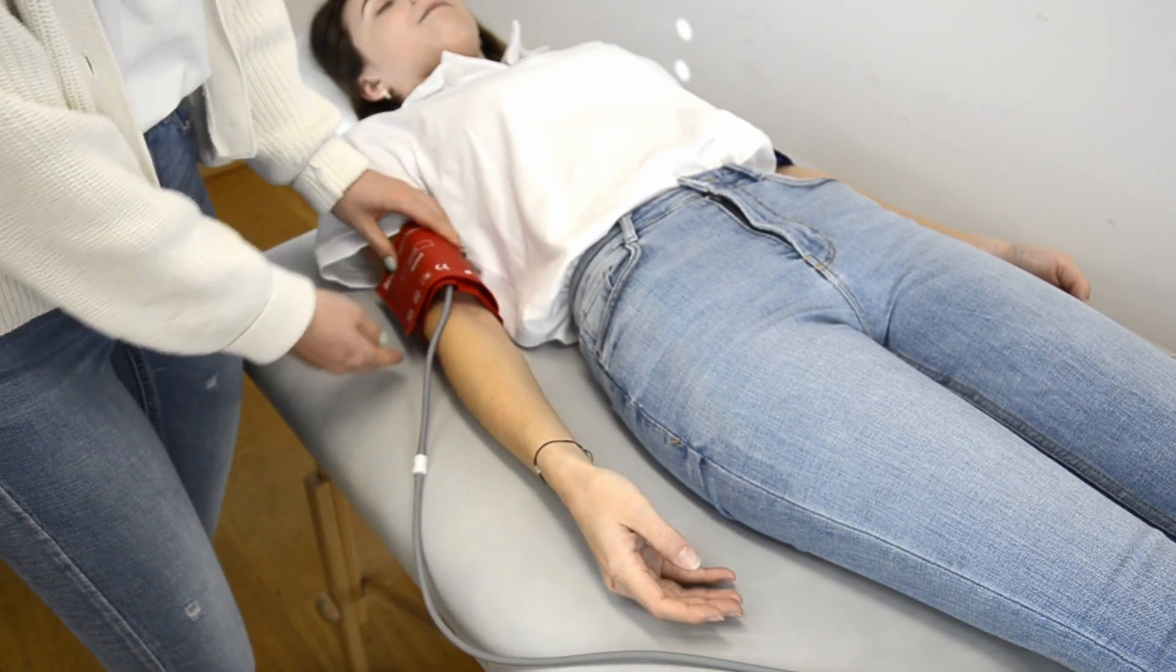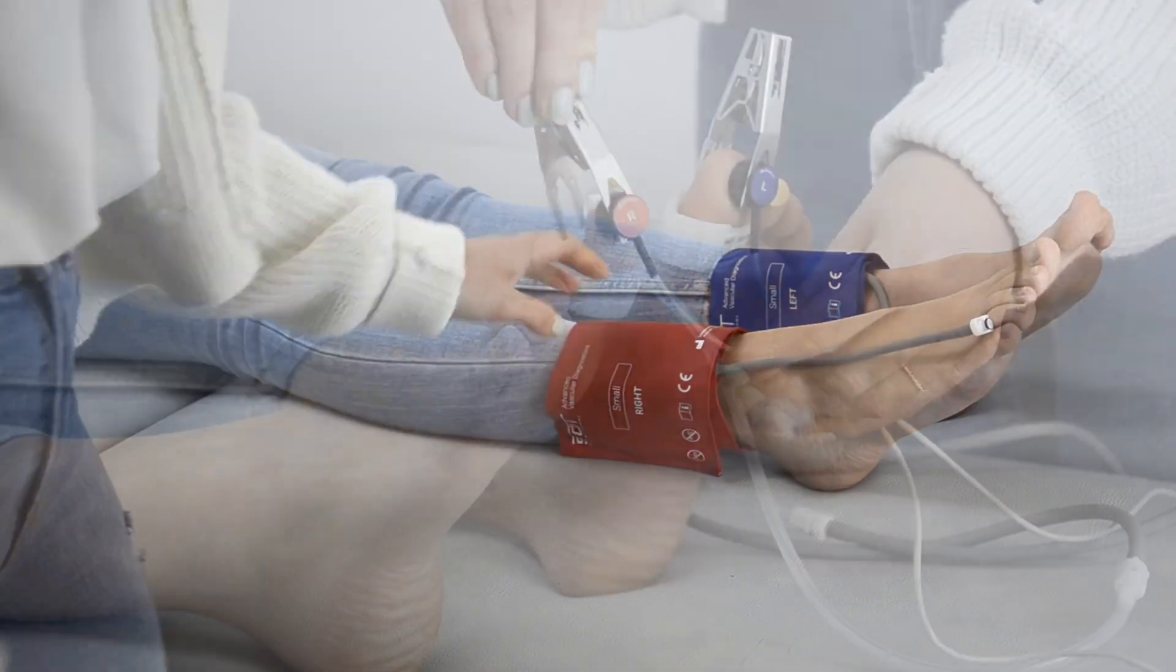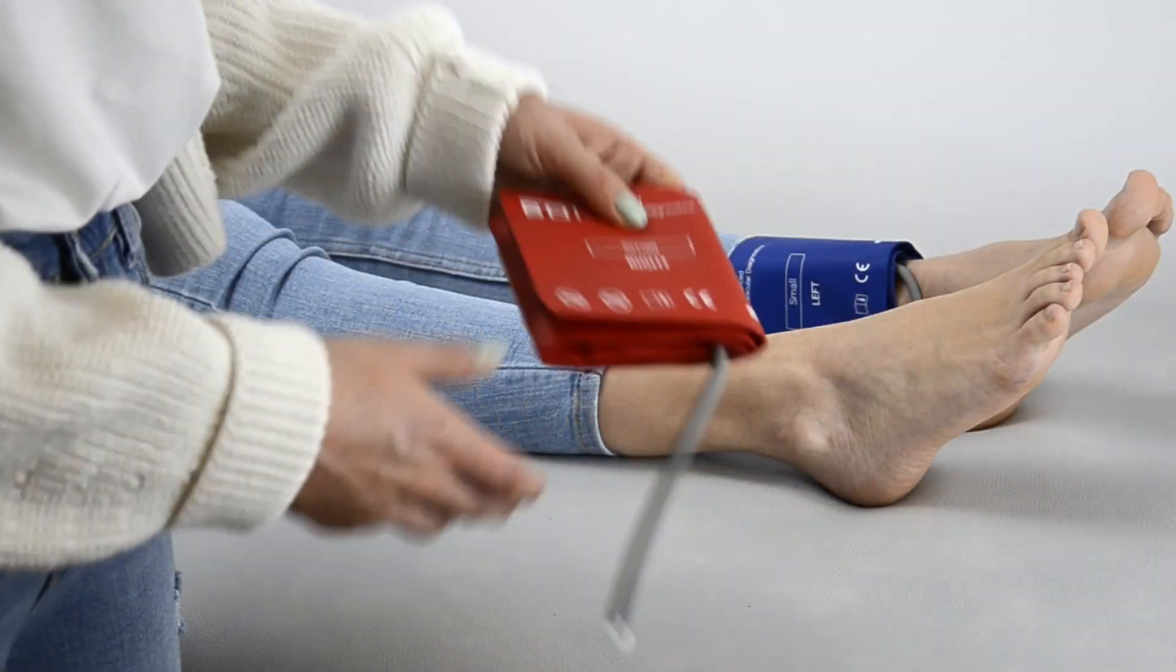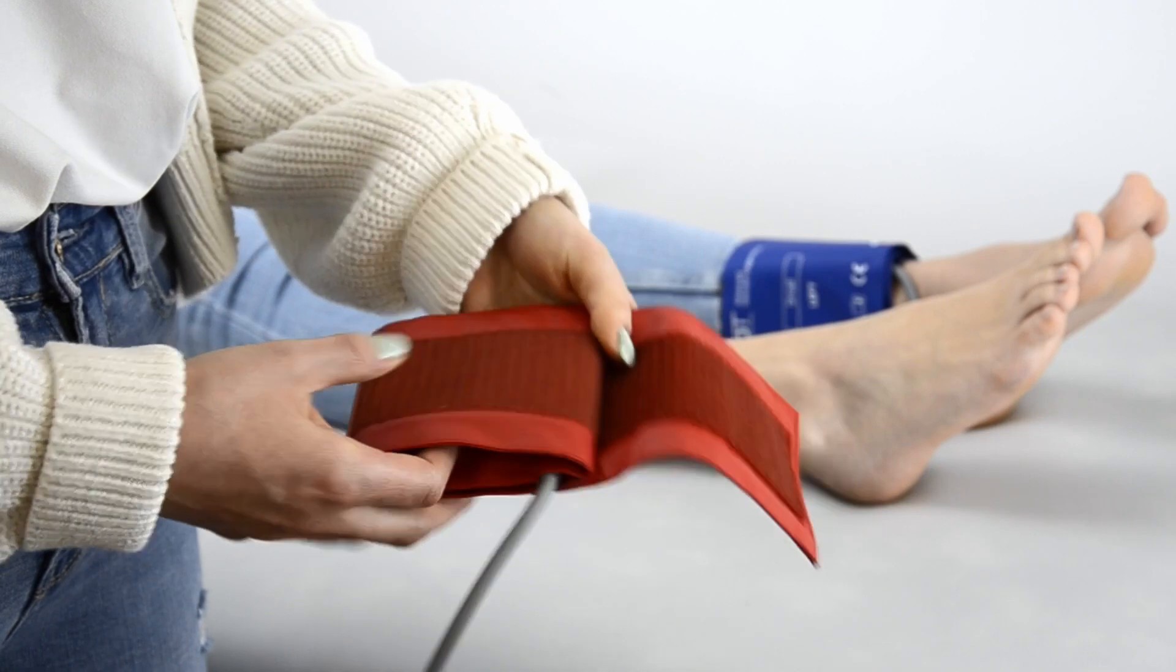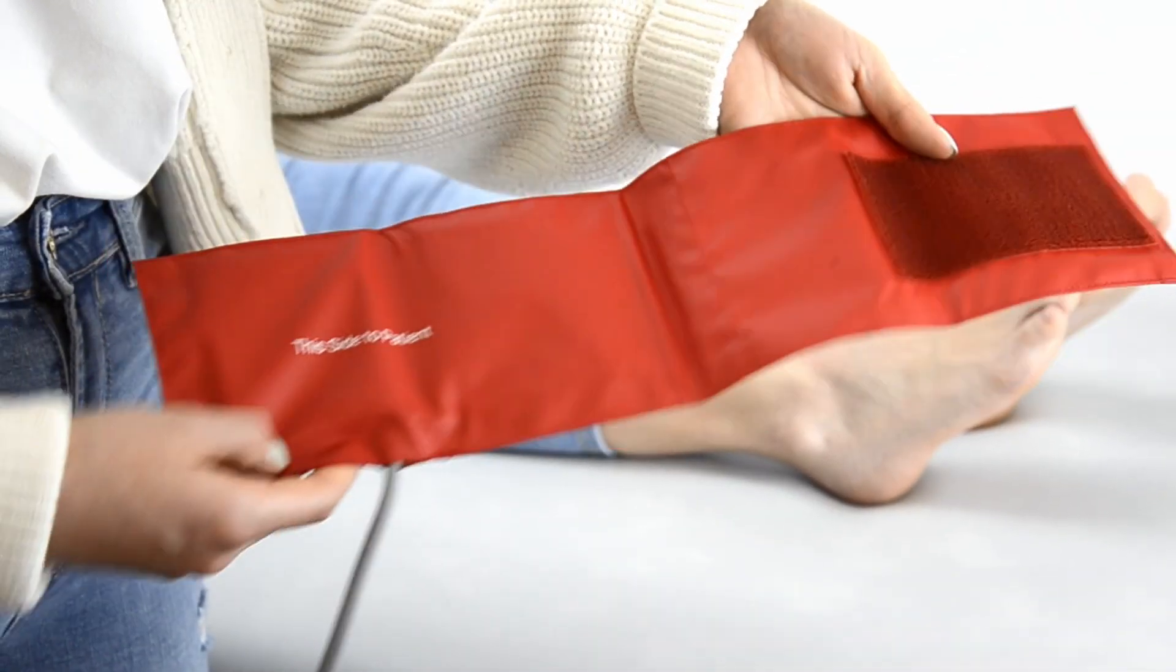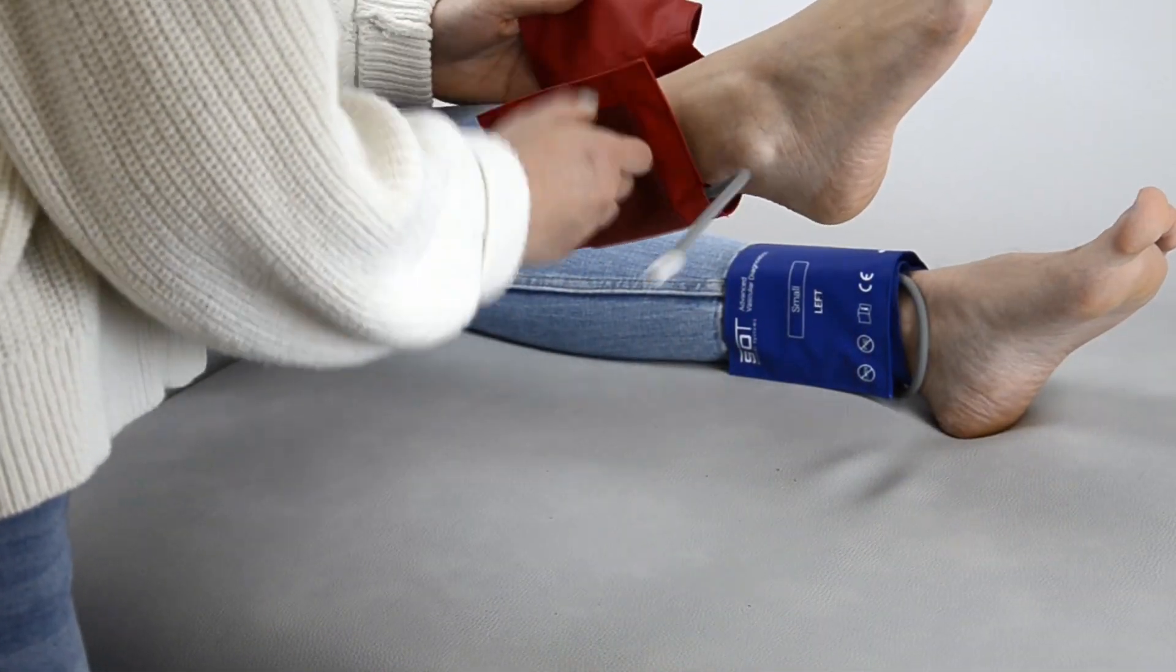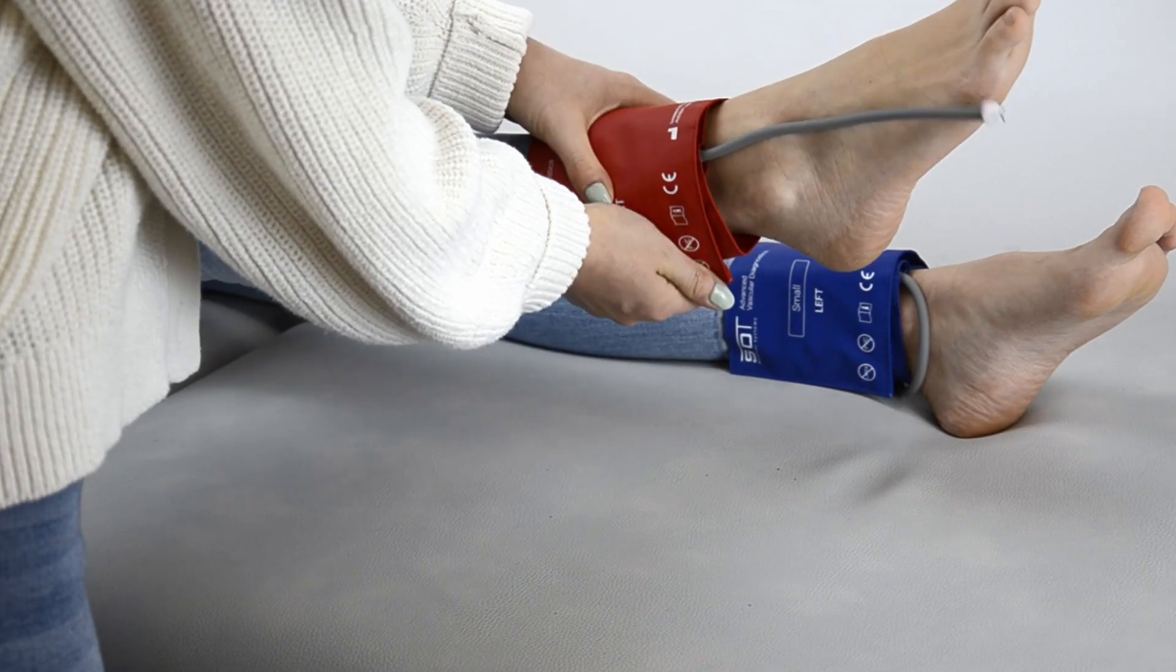This procedure has to be done for upper arms, ankles and optionally for the toes. Apply the ankle cuffs as indicated. Be sure to have the correct side of the cuff facing the patient. Make sure that the cuffs are equally tight placed on the left and the right side of the body.